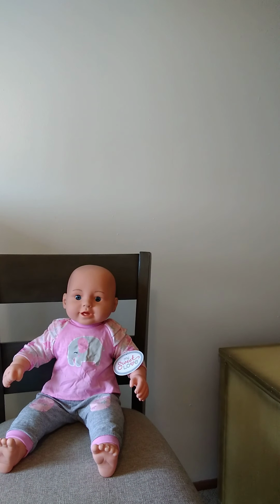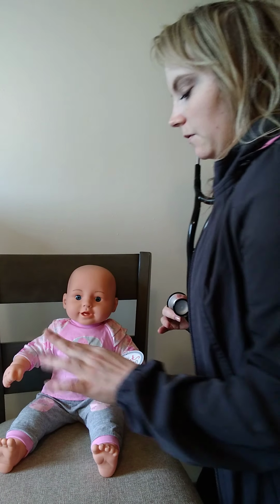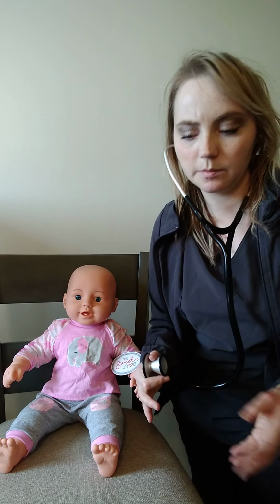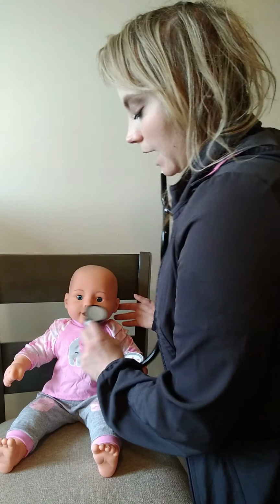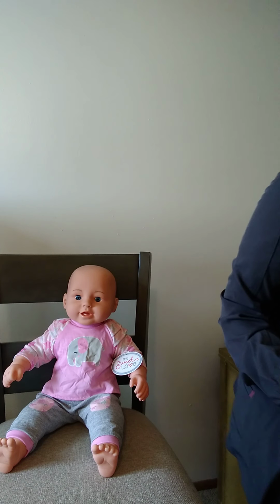All right, then I'm going to palpate the carotid artery one at a time with my fingers. I'm going to start on the left, one at a time. I don't feel any feelings of it being thready. It just seems normal. Then with the bell of my stethoscope, I'm going to listen to each side one at a time again. I don't hear any bruits, no slashing or swishing sounds, anything like that.